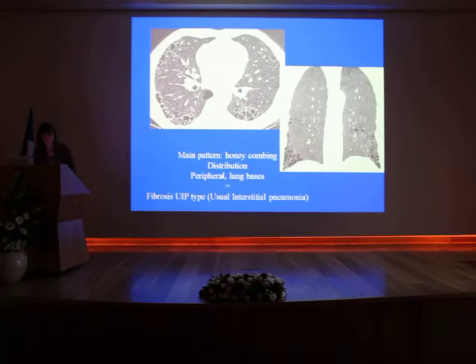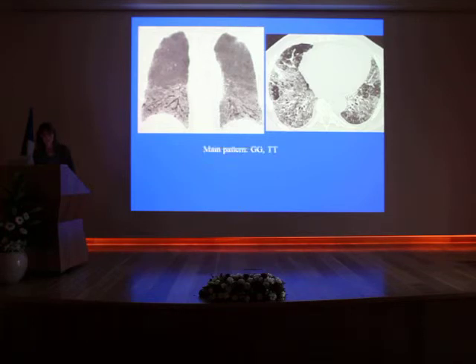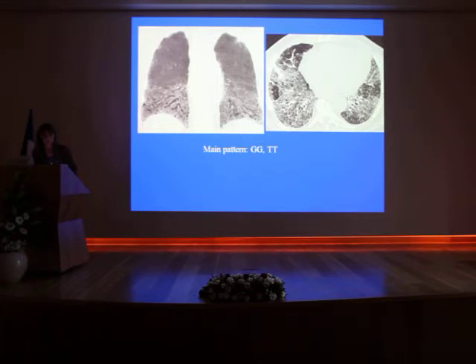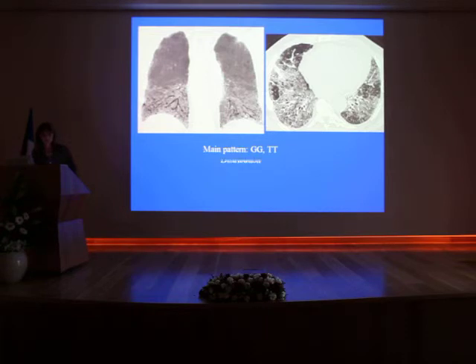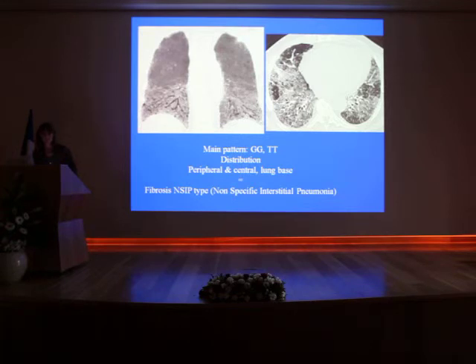Here the main pattern is ground glass with traction bronchiectasis. You can see this is a minimum intensity projection reformation, which helps differentiation between cavities due to honeycombing and enlargement of the bronchi. The main pattern is ground glass and traction bronchiectasis — this is NSIP. You can see the patient had a surgical biopsy to confirm the diagnosis.